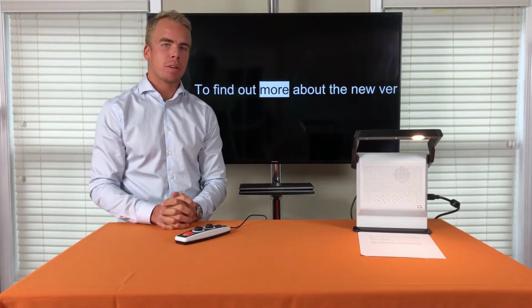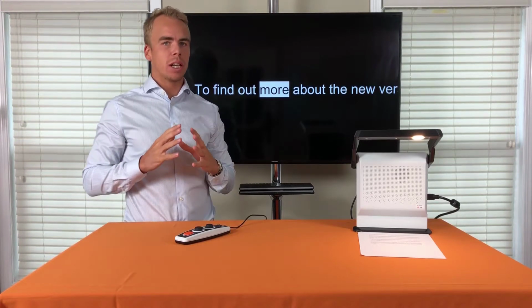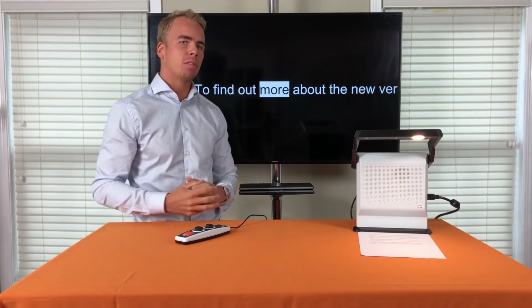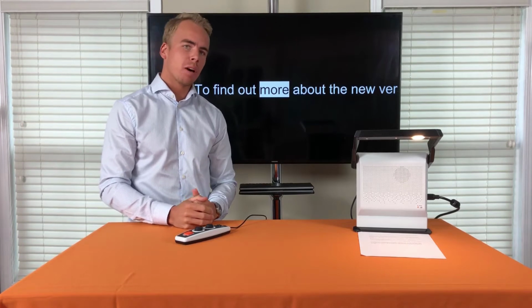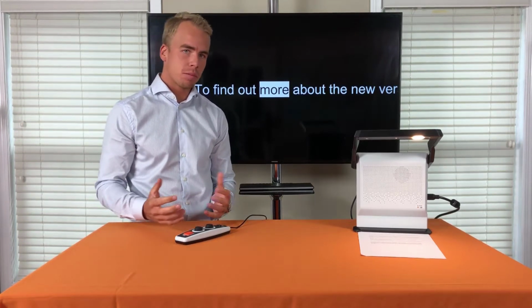Christopher with LVI America. In this video, I will take those of you who would like to go very deep into the MagniLink Voice 2 to find out how you can customize the product for your needs and how you can adjust some settings.